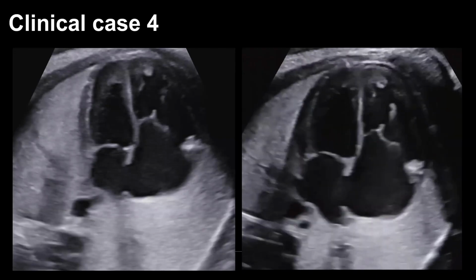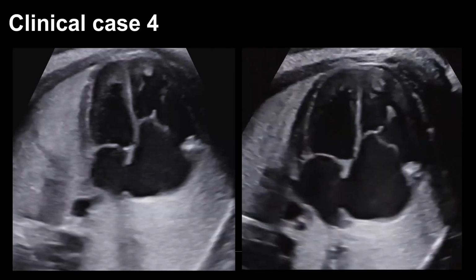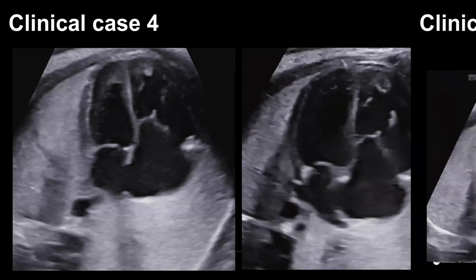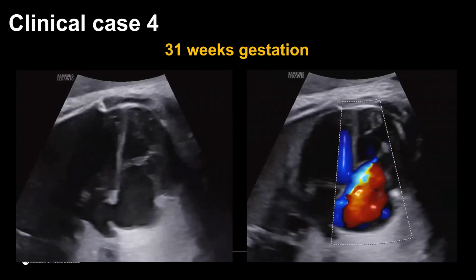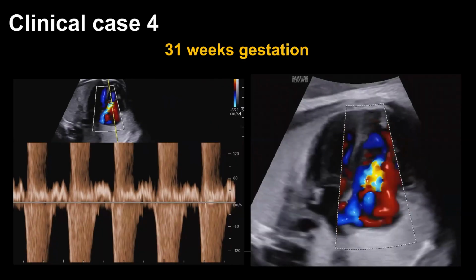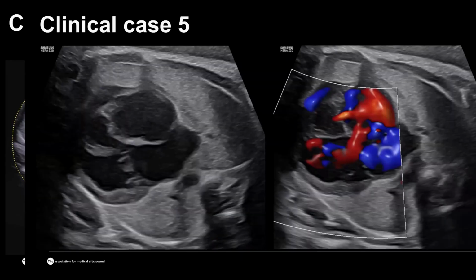And this is where the situation may develop later in the pregnancy. That's why there is a huge discussion about whether we should do the third trimester assessment routinely to pick up situations like that. And this is the classic Ebstein anomaly, the significant displacement of the septal leaflet of the tricuspid valve towards the apex. And here is the confirmation using the color Doppler and the spectral Doppler, and all the measurements. We can demonstrate the cardiomegaly, and we can directly measure the displacement of that leaflet.